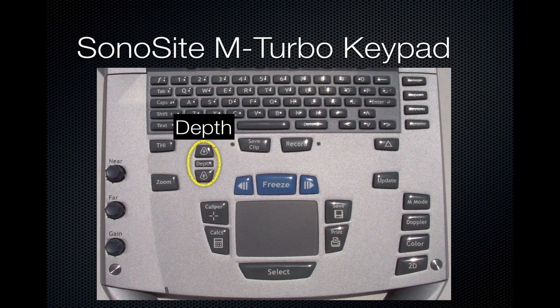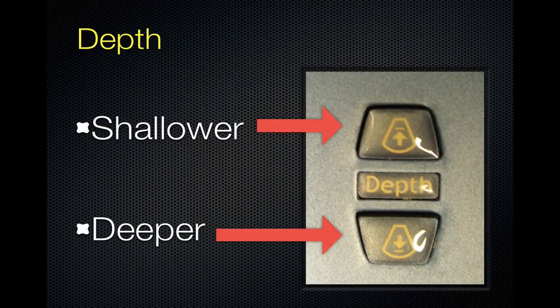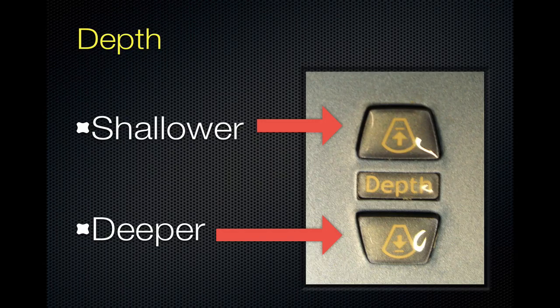Several sets of keys on the Sonosite M-Turbo keypad allow you to optimize your image by adjusting things such as depth and gain. Depth buttons are located here. It is important to center your object of interest in the middle of your screen. If you need the screen field to be shallower, use the top depth button. If you need the field to be deeper, press the bottom depth button as many times as necessary to achieve the depth you need.